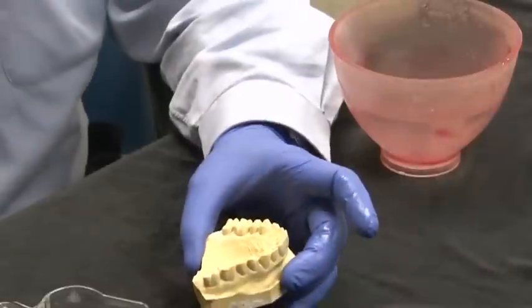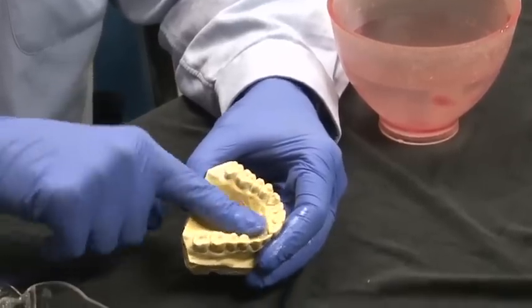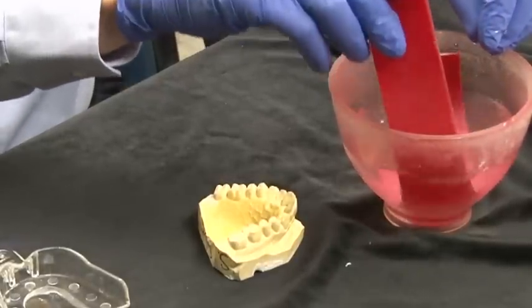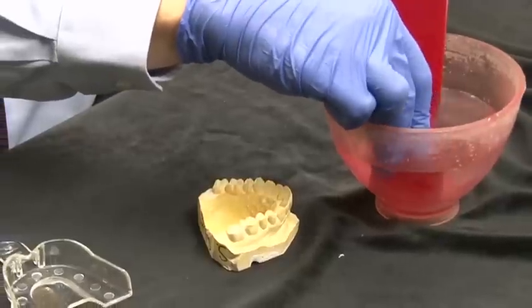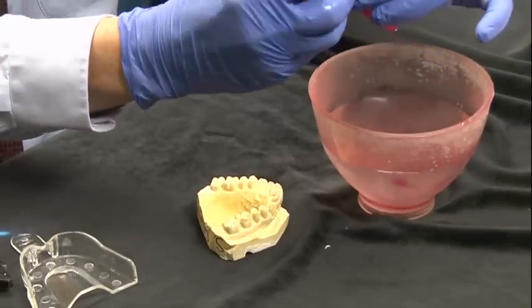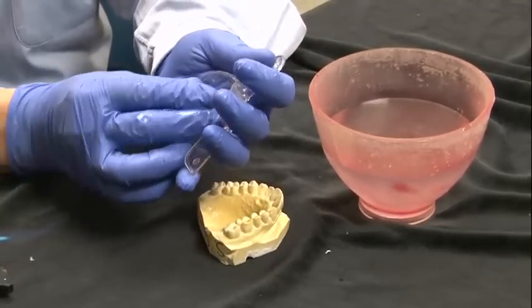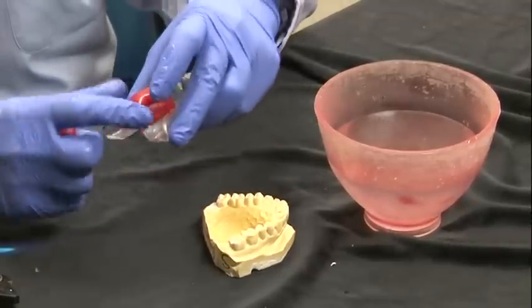We take the Vaseline and smooth it out over the model, then go ahead and take some wax and put it in. The instant hot really helps to warm it up evenly and pretty quickly. We place that on the palatal part of the tray, and again this is something that your dental assistant can have all ready for you before the patient ever came in.